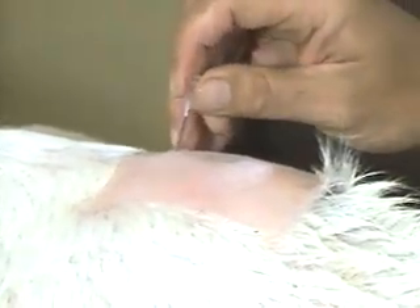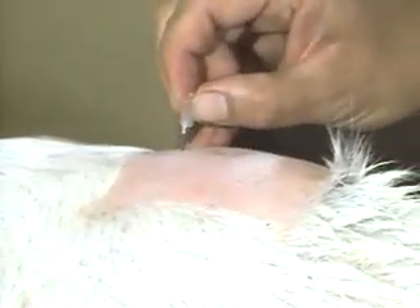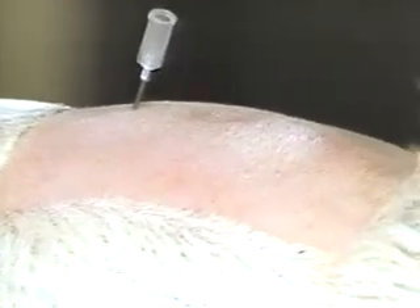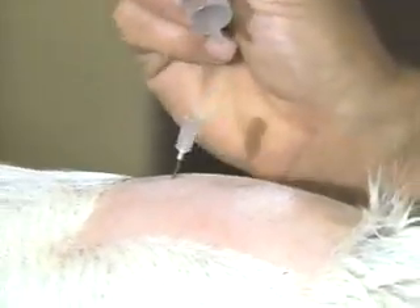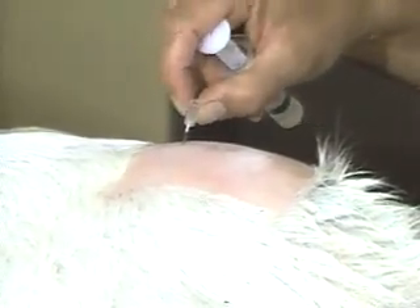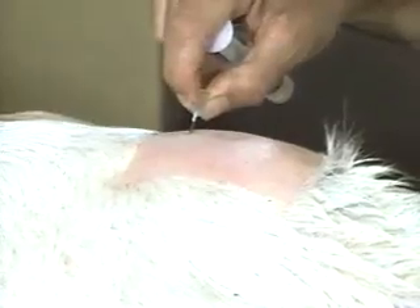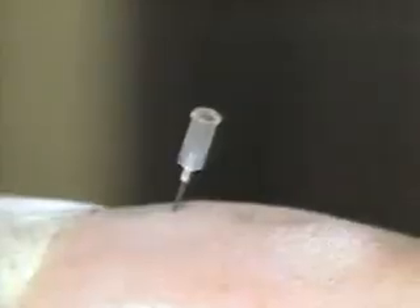Most cattle make a slight movement at that point. If you have some question about the disposition of the animal, it would be best to stand off to the side or in a frontward position so that she doesn't kick you. There are some tests to determine when the needle is in the right spot. You can see that approximately one inch of that needle is buried. I felt it go through some ligamentous tissue, and now it's resting just onto bony tissue, and I've withdrawn it just a very small amount.